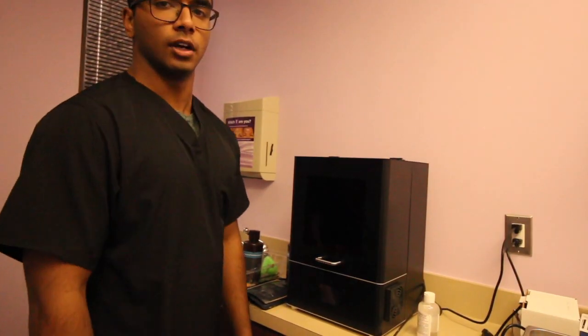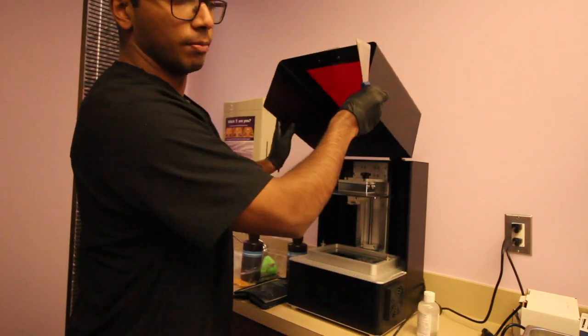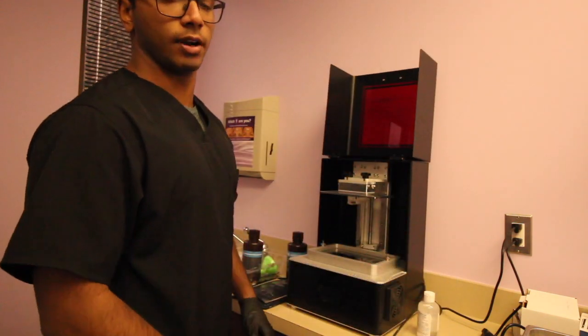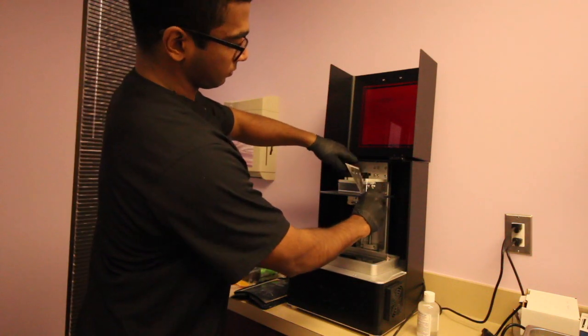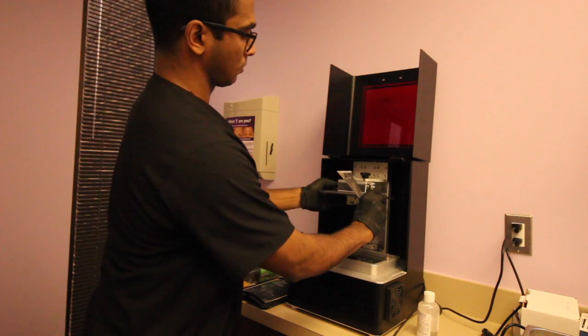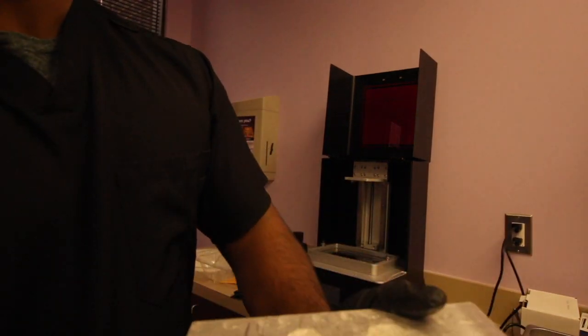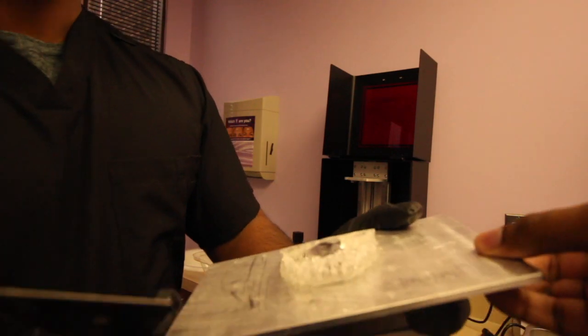So after 3 hours, our bite guard finally printed. So now I'm going to take it off and put it in this ethanol bath so we can get the excess resin off of it. So here we have our printed bite guard right here, looking pretty nice.